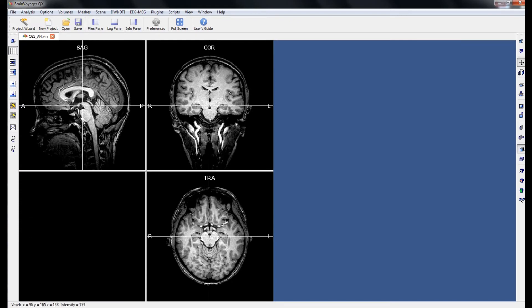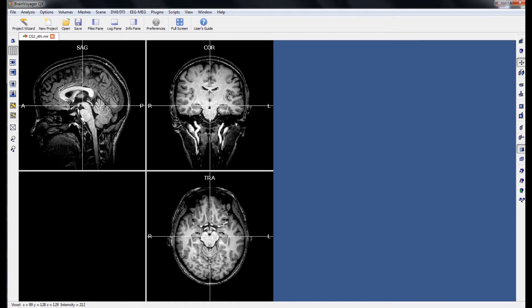So what we ultimately want to do is to display data on an inflated cortical mesh, the mesh being a representation of the boundary between the white matter and grey matter. To do this, BrainVoyager needs to know what is and what isn't white matter and grey matter. We can help BrainVoyager by correcting for inhomogeneities that exist in the intensity values of the white matter and the grey matter.